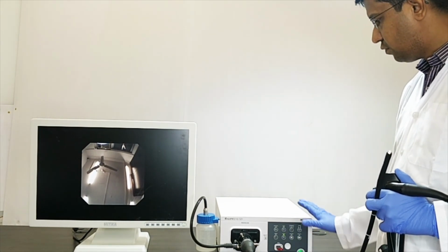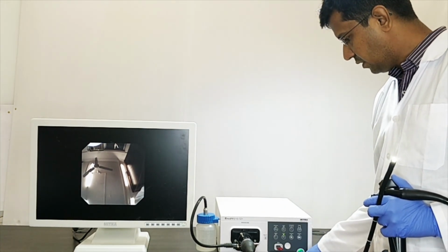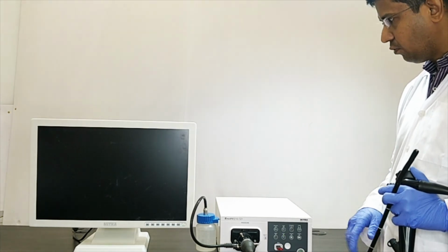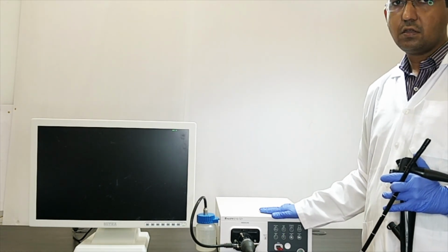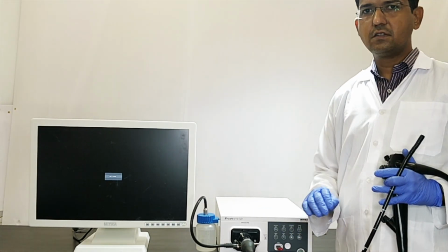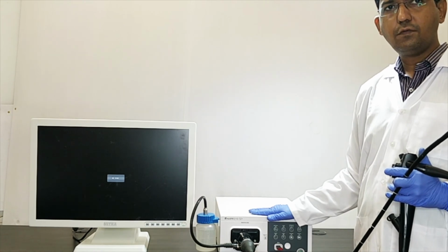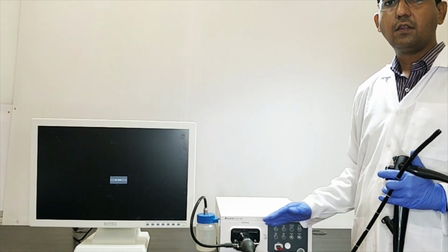To switch off this video processor, you just press this button. Now your video processor is turned off. So this is the complete setup of the SmartEye-II Plus video endoscopy system. Thank you.